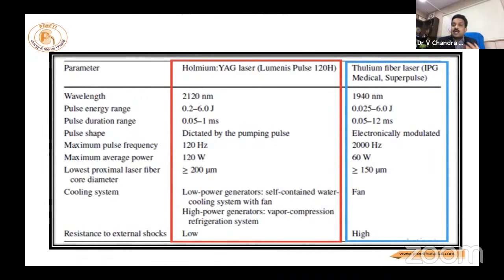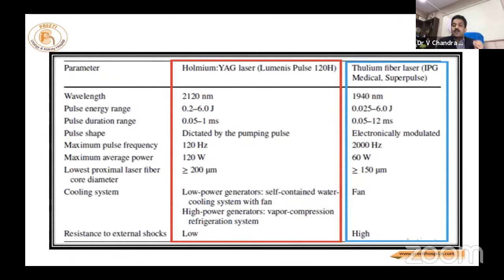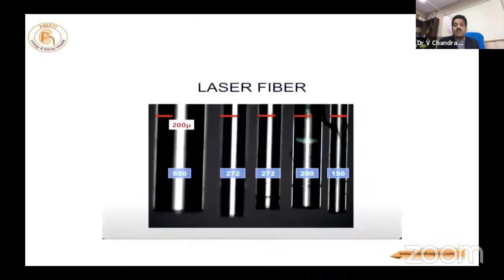The ultimate concept of today, what Dr. Mahesh Desai sir explained, is that if you leave any stone, whether in RIRS or PCNL, the chances of regrowth and failure are higher. So on the table, if you can see it clear with suction, then you have to dust or make particles in such a way that they come out through the suction. This I have already told. See, the laser fiber is also very thin in the thulium fiber laser.